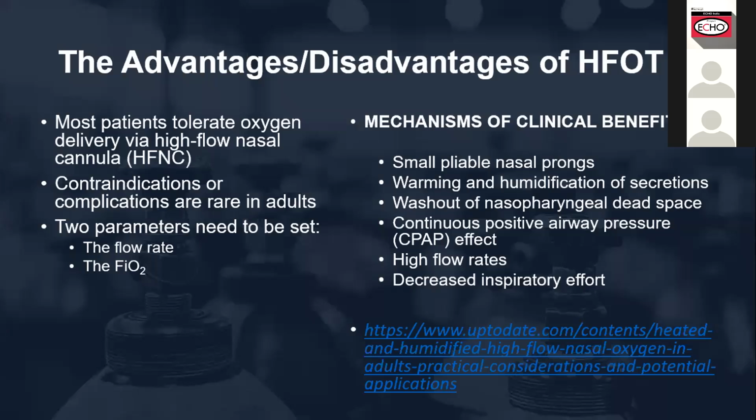So most patients tolerate oxygen delivery via high flow nasal cannula. Contraindications or complications are rare in adults. So really here you need to set the flow rate and your targeted FiO2. Then the clinical benefit: this is a small and pliable nasal prong.